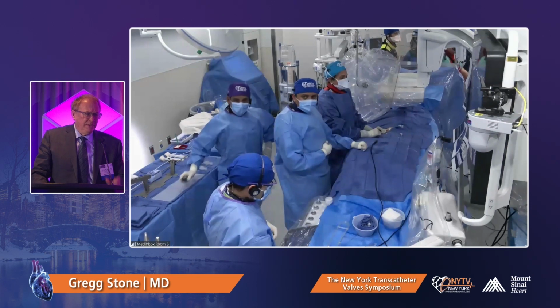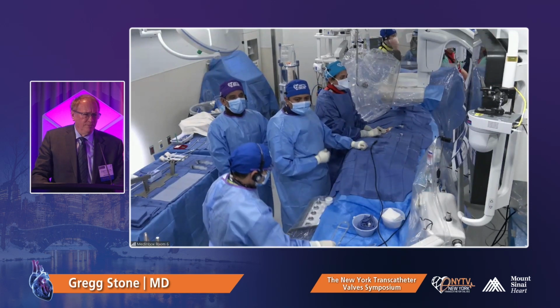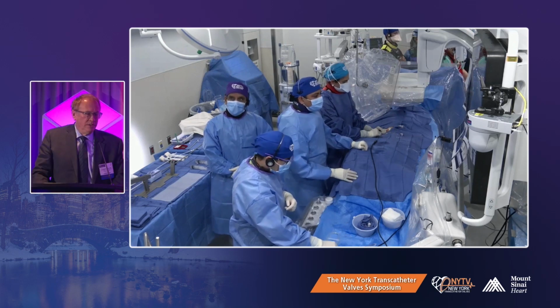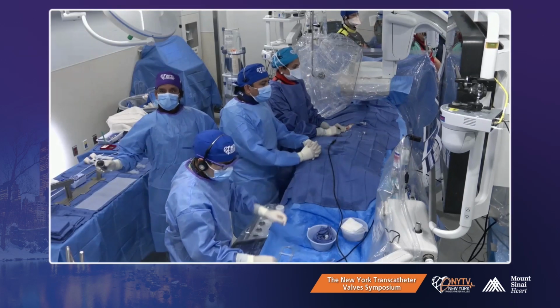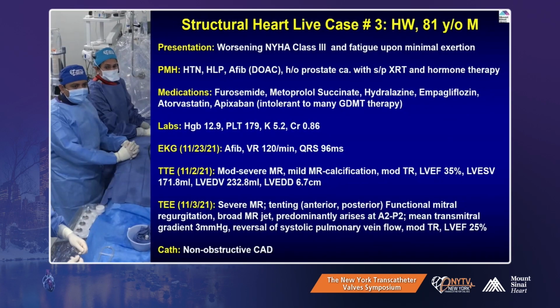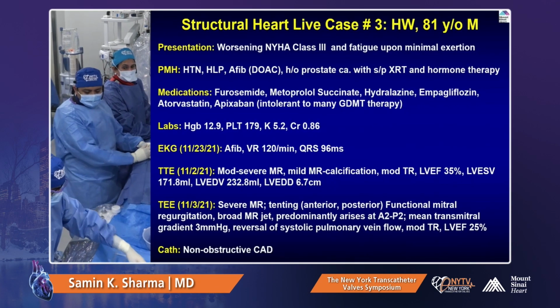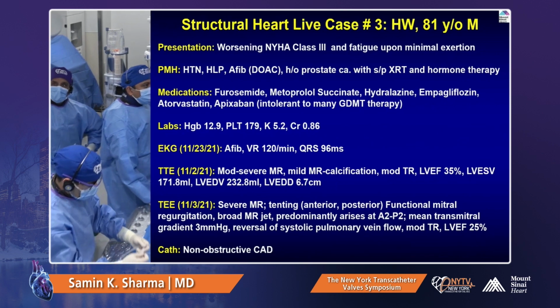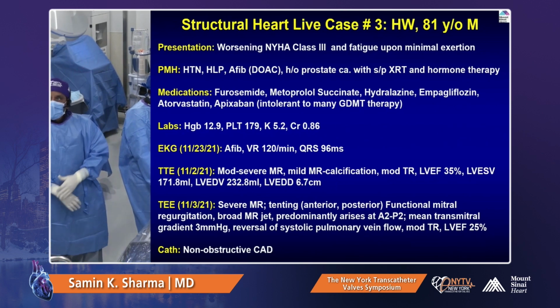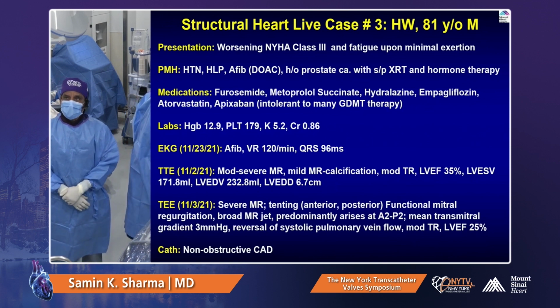All right. So post lunch, welcome again from the cardiac cath lab, and we go to case number 3. Between the tower cases, we have sandwiched mitral. Okay, let's go to this case. An 81-year-old male with worsening class 3 heart failure, and the most prominent symptom is fatigue.